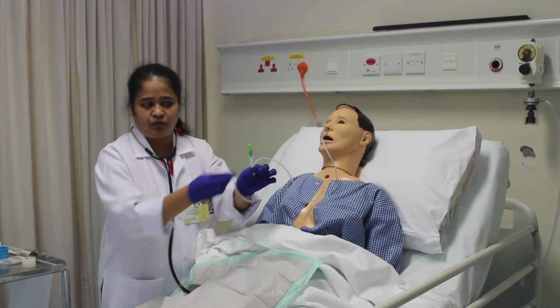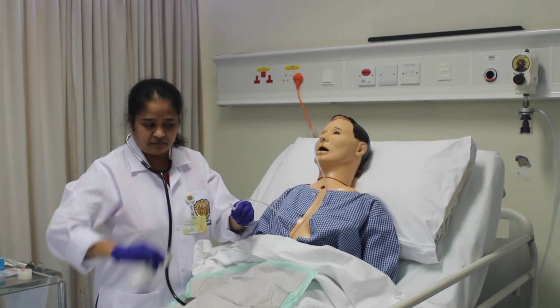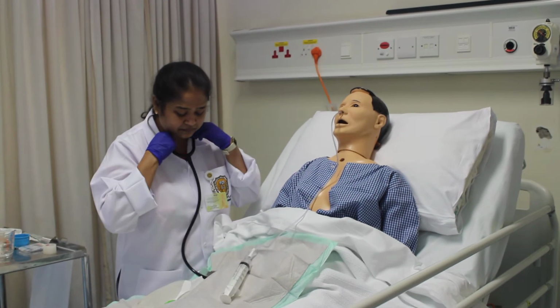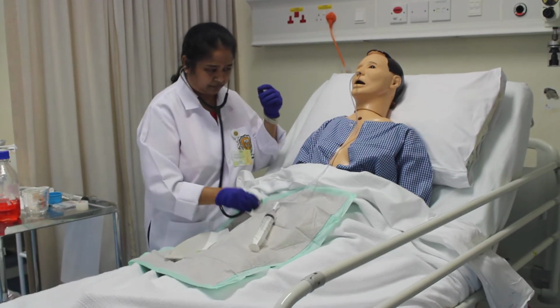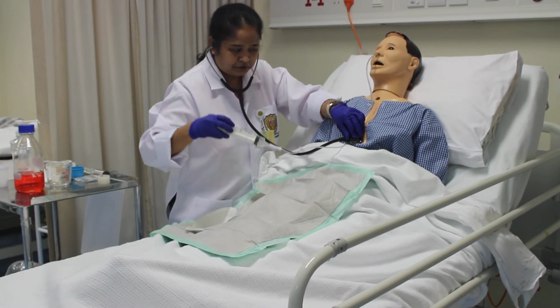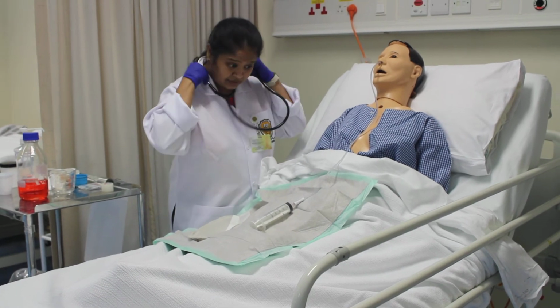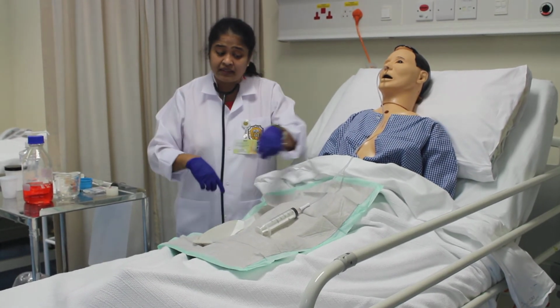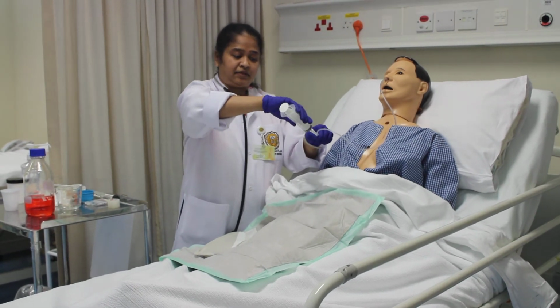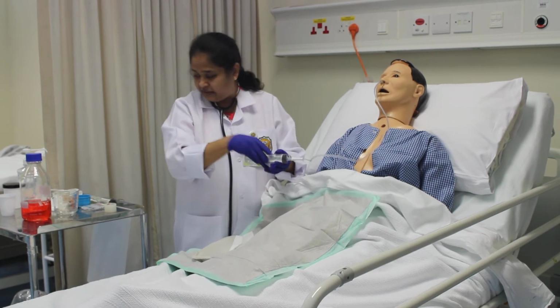Whenever you open, try to pinch the tube. What is the reason? We do not want any air to go inside unnecessarily. When I am pushing, I could hear the whooshing sound very clearly. So that is the second indication that it is there in the stomach. I have one more way of checking it. What is the third way of checking?